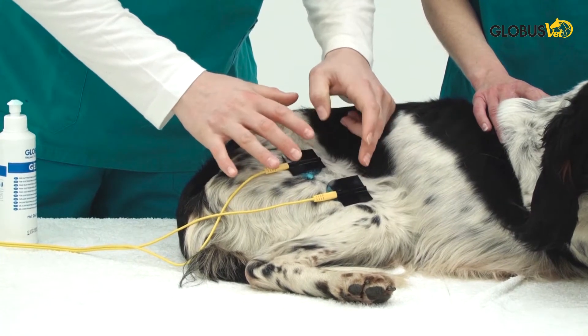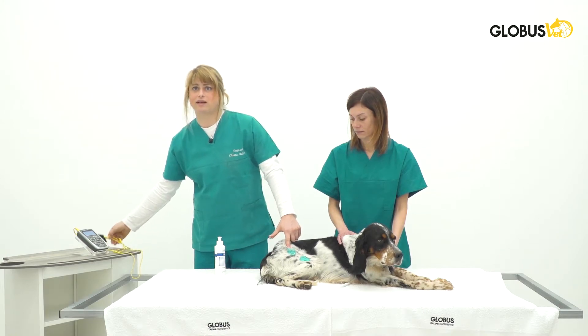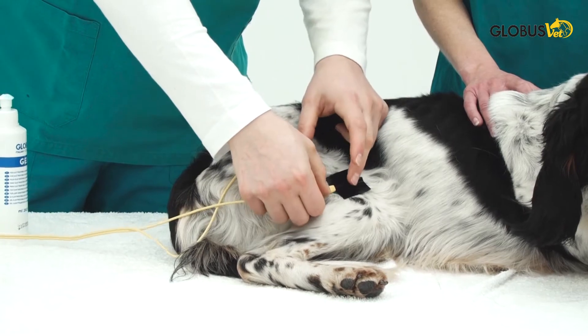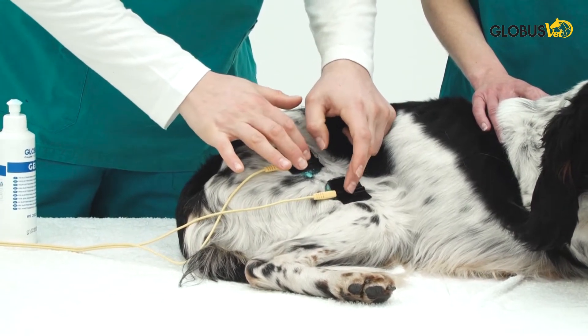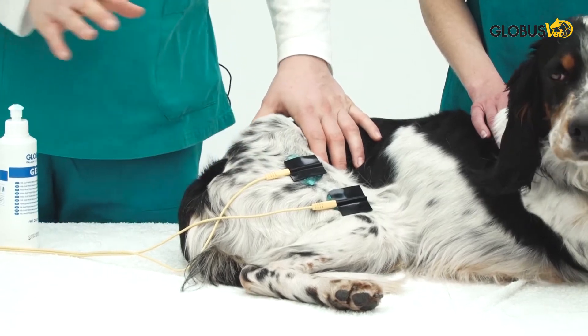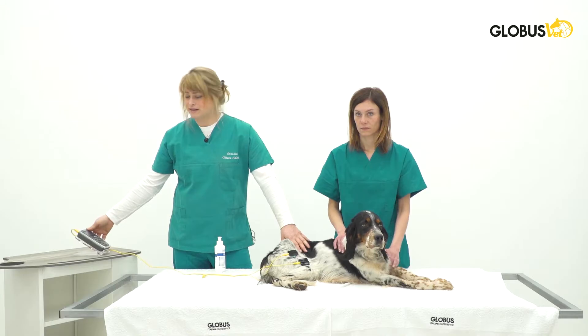We already put the gel on this patient. We'll go over to the handle and take our electrodes, place them on, and we don't have to keep them still because the gel already keeps them stuck onto the patient. After that we will set up the intensities.